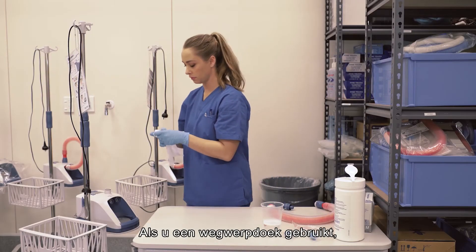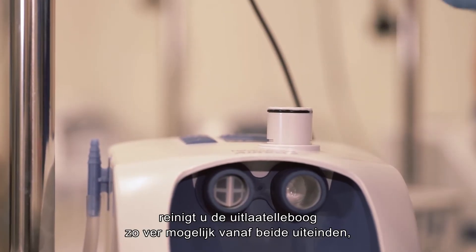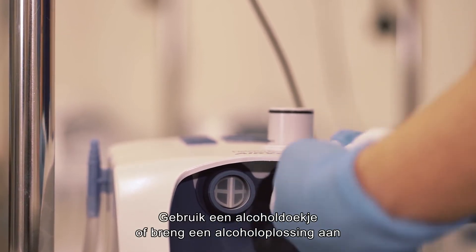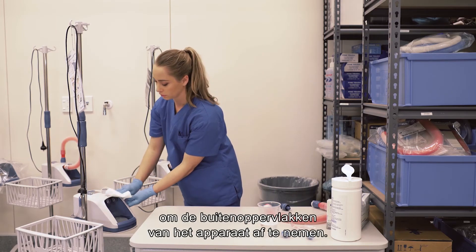If using a disposable cloth, thoroughly clean the outlet elbow from both ends as far as possible, continuously rotating the cloth with your finger. Use an alcohol wipe or apply an alcohol solution to a clean damp disposable lint-free cloth to wipe the outside surfaces of the unit.